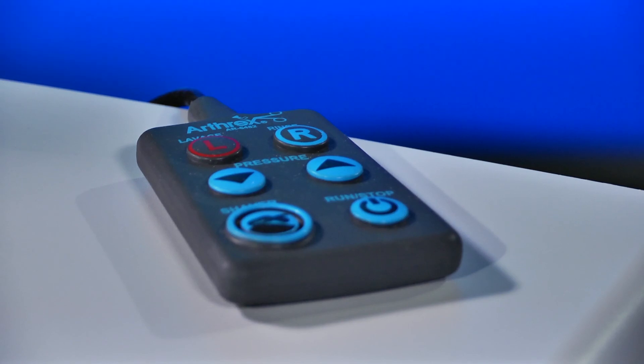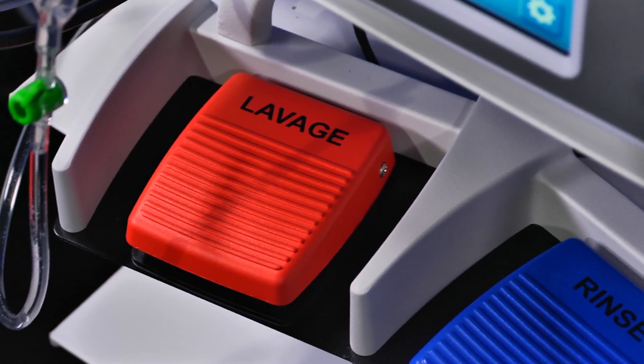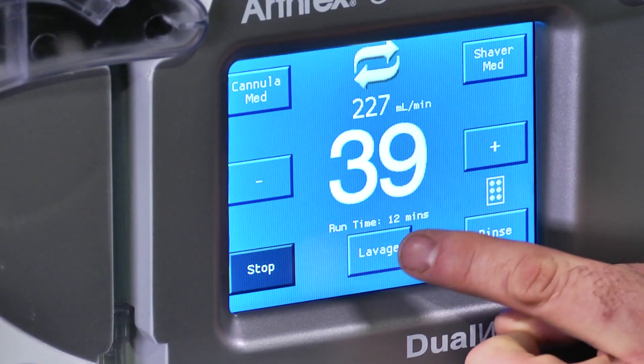The controls for the lavage mode are indicated by the red L button on the autoclavable remote, the red foot pedal, or the lavage button on the video touch panel display.